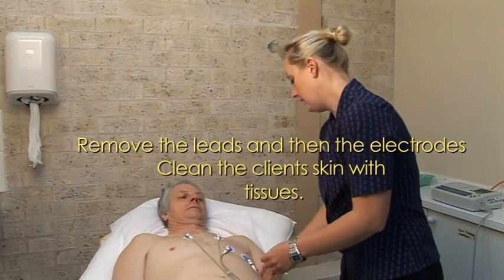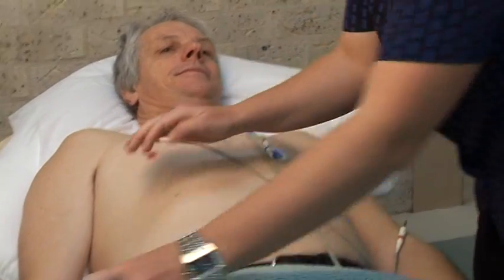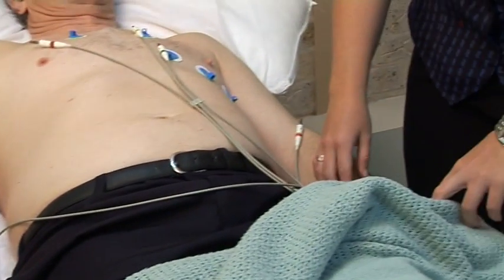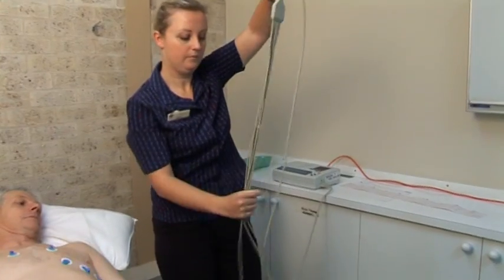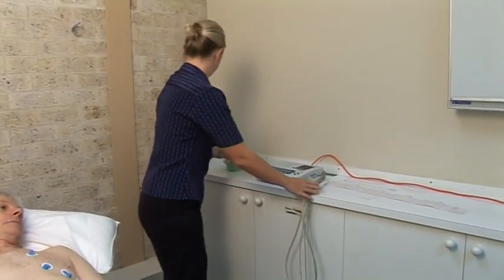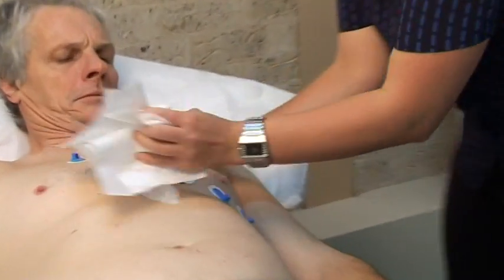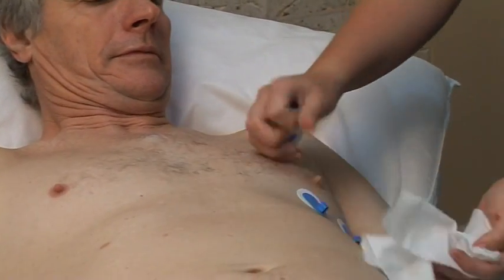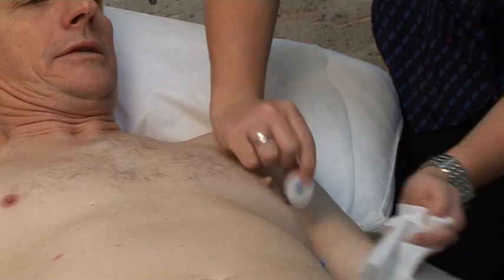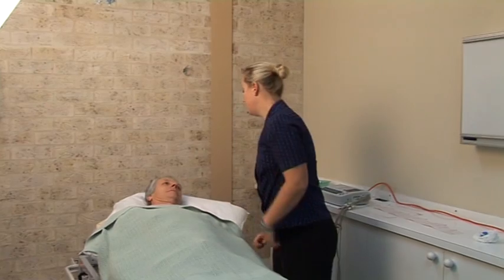The test is finished, okay? Thank you. Take the electrodes off. They may be a bit sticky. Now that everything's removed, you're free to go. I'll just place the blanket up. You're right to get dressed and leave.